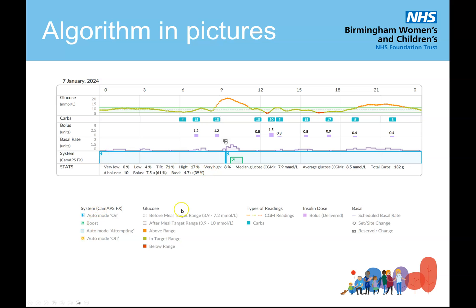You can see where the algorithm is on, and if boost is active you'll see where the algorithm is giving extra insulin with amounts increasing, and on the lower side you'll see no increases. This gives you a lot of information about user behavior — does the carbohydrate counting look accurate, are they giving an adequate number of meals, how the bolus incidence is going in, and if boost is in use you'll see the algorithm increasing in its intensity. Across the bottom you can see metrics like 4% low, 71% time in range, and 132 grams carbs, giving a lot of information from an individual day perspective.